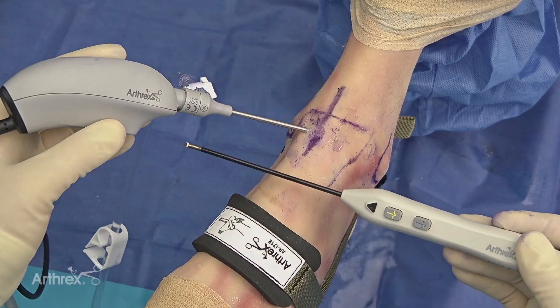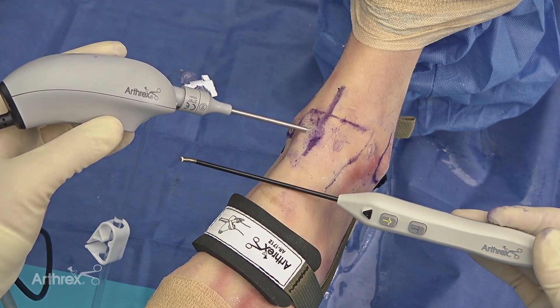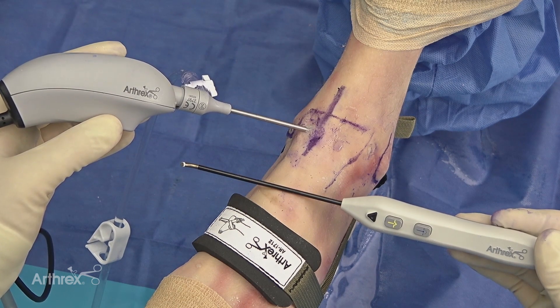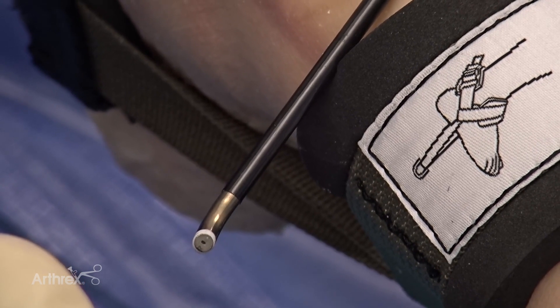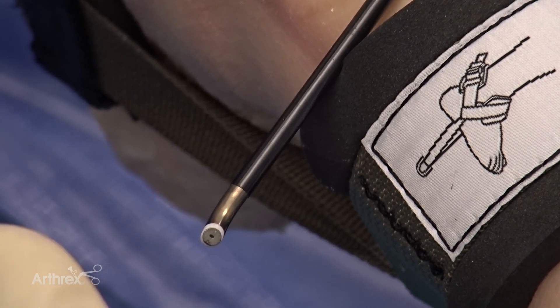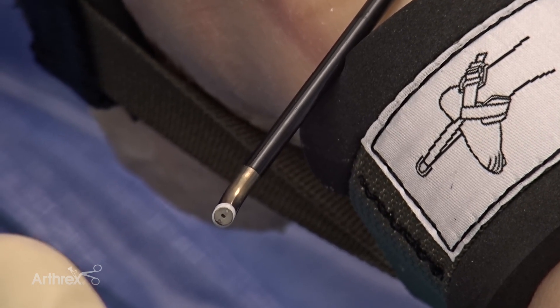Let's assess a case where you have some mild chondromalacia of the talar dome. Treating this would involve debriding it and doing a chondroplasty as well as removing any loose debris in the ankle joint. A good option is the SJ50, now available in a shorter working length at 110 millimeters with a smaller diameter than the MP50 at 3.3 millimeters and a 50-degree curve, which allows for a lower default setting and aspiration to keep the fluid temperature in the joint low.